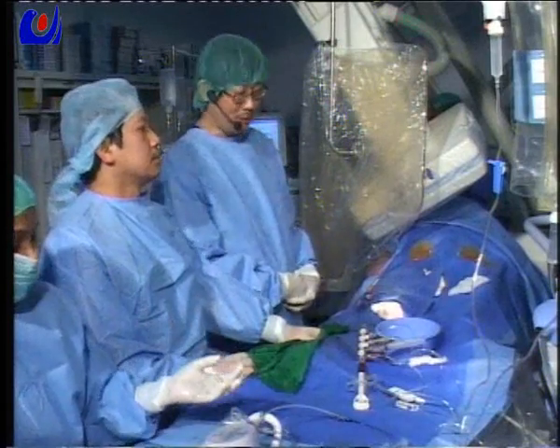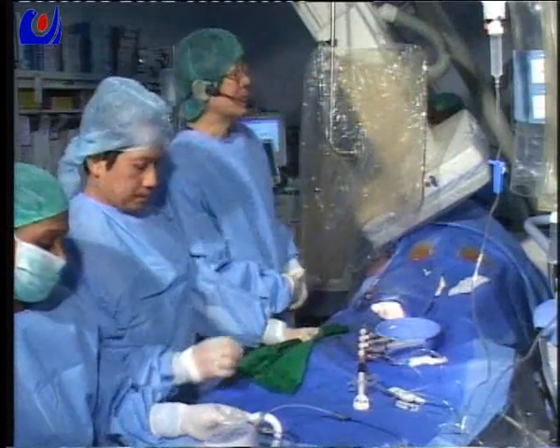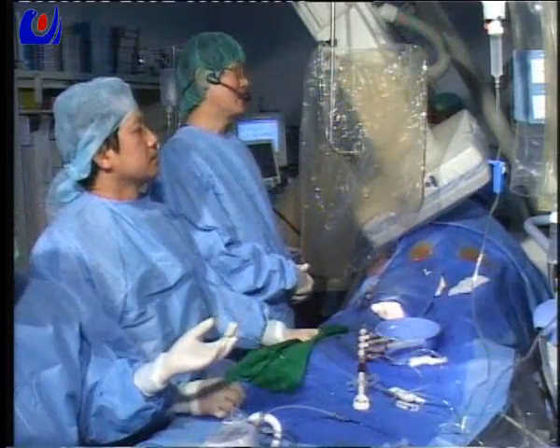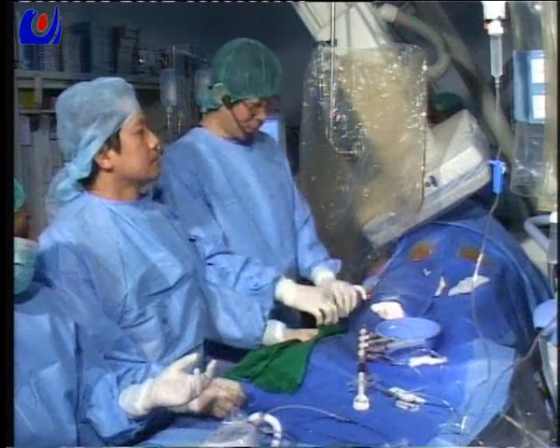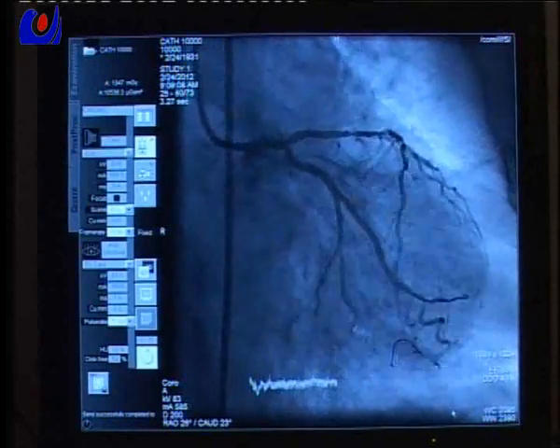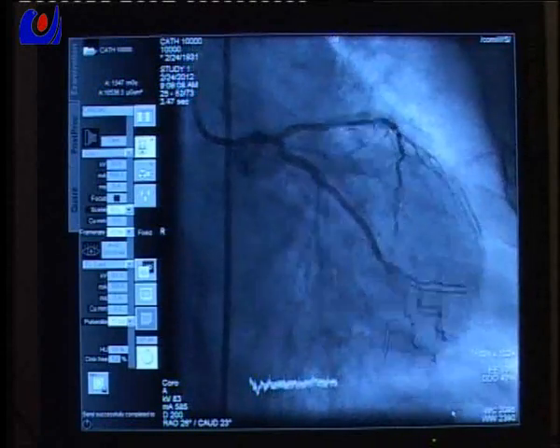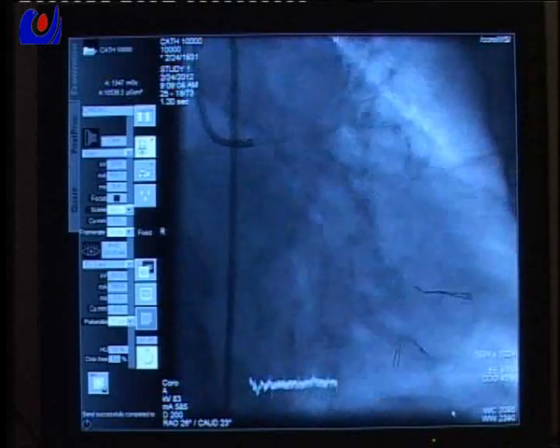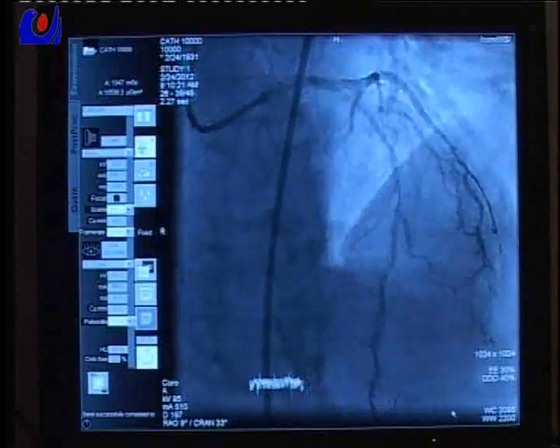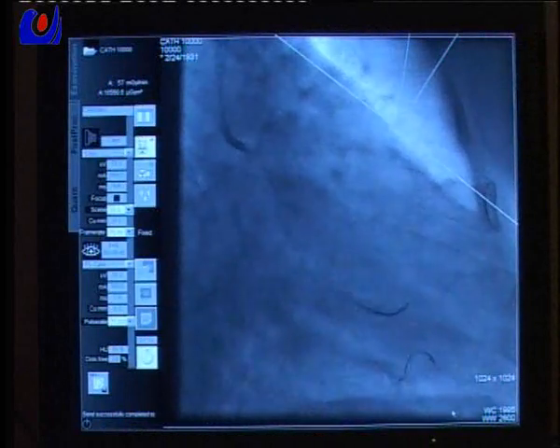So the lesion was just below the original bare metal stent and proximal. Then after that, they have LAD ostial critical stenosis. From the caudal view, it seems like the left main does not have significant disease, but from the cranial view, it's showing some borderline stenosis. So we have to check with IVUS. After we do additional high pressure inflation using a 2.5 by 15 NC Sprinter, now the patient has relatively calmed down, we can do an IVUS. Hopefully we can have the IVUS information, and decide where to go and what to do for this patient.